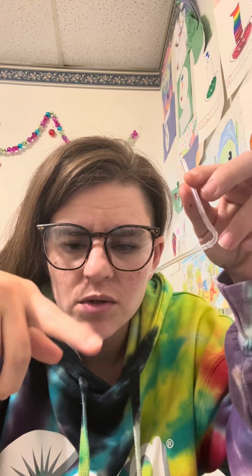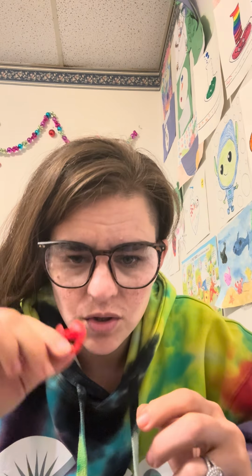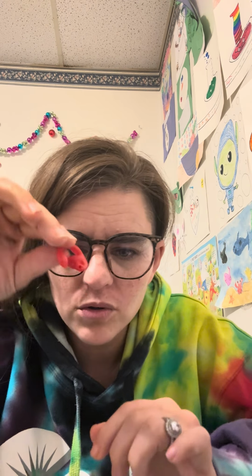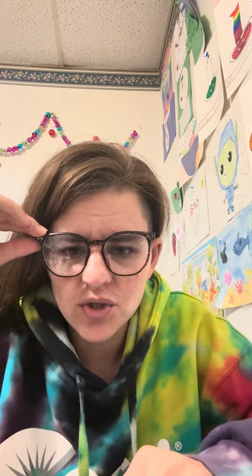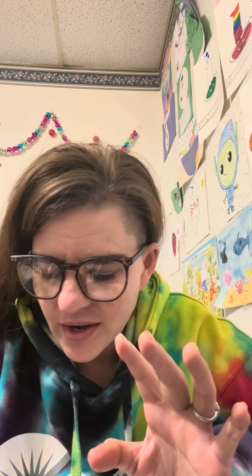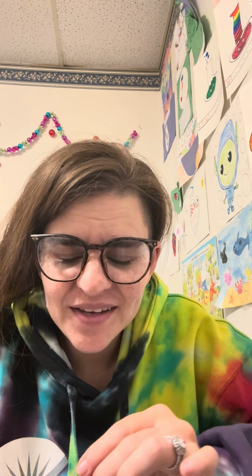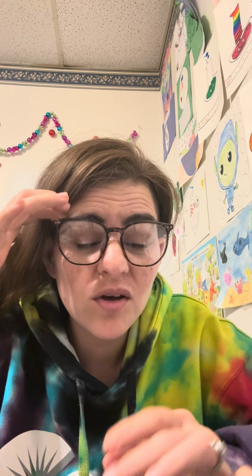Whatever tubing you need, ask your audiologist. And your audiologist can also give you a tutorial on how to change your tubing. They can show you. But before you do any maintenance, please ask your audiologist. I've changed my tubing so many times by myself. I'm like an expert. But I did get this new mold. And the hole where the tubing comes in is extra tight, more than any other mold that I've ever had. So a friend of mine gave me this tube puller, and I've watched many tutorial videos which were absolutely no help whatsoever.